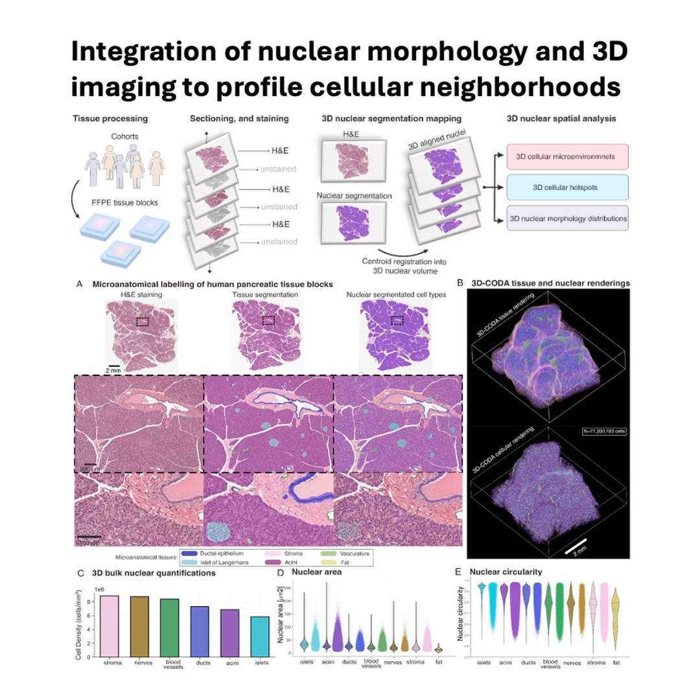Let's talk about the first big finding. Just the sheer level of tissue and cellular heterogeneity they could now see. Yeah, the scale itself was kind of staggering. The first sample they fully reconstructed and analyzed was roughly 16 by 14 by 2 millimeters. It doesn't sound huge, but... How much tissue is that, actually? Well, the volume was over 452 cubic millimeters.